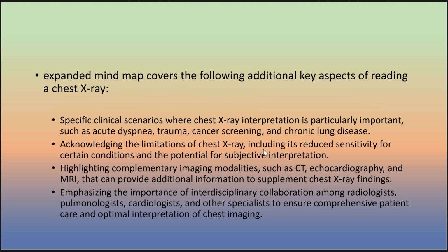This extended mind map covers the following key aspects of reading chest X-ray: specific clinical scenarios where chest X-ray interpretation is particularly important, such as acute dyspnea, trauma, cancer screening, and chronic lung disease.